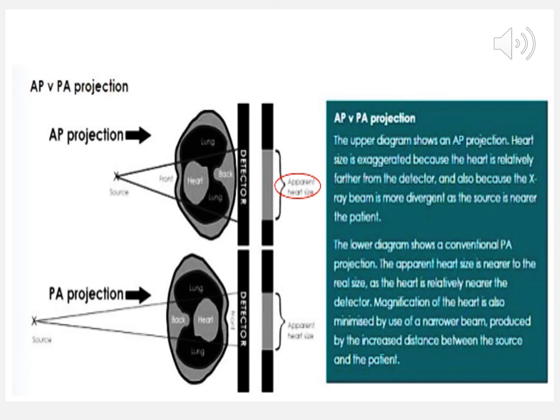So study that. You may see that in an X-ray interpretation of a portable chest or a PA of the chest or an AP of the chest, and the radiologist reads it and he says heart appears large in size, may be exaggerated because of portable technique or because of AP positioning. So that sort of explains why that happens.